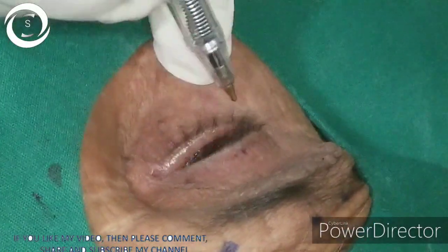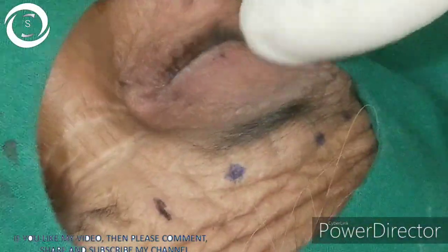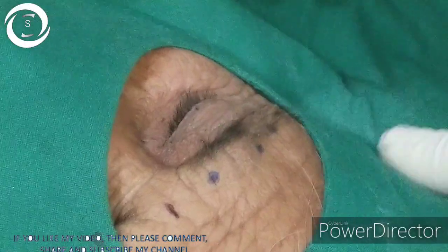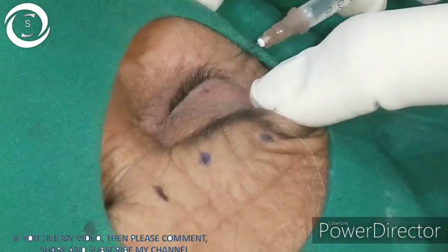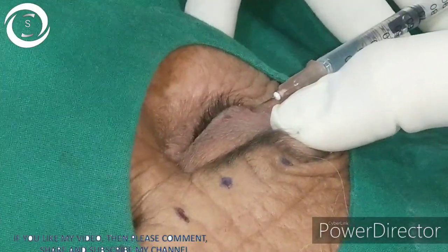You can also mark the center of the forehead — the procerus muscle — because it is also hyperactive in blepharospasm. In summary, the most common points are: two points in the inferior eyelid, three points in the superior eyelid, three points above the eyebrow, and one in the center. That gives eight points on both sides of the eyes and one in the center. You can also add an extra point at the lateral canthus if there are marked crow's feet or that area is actively involved.